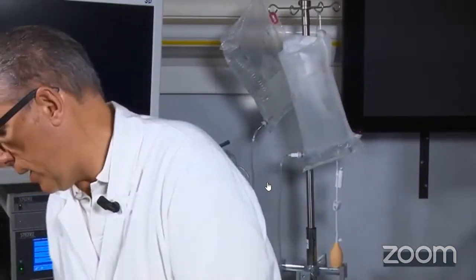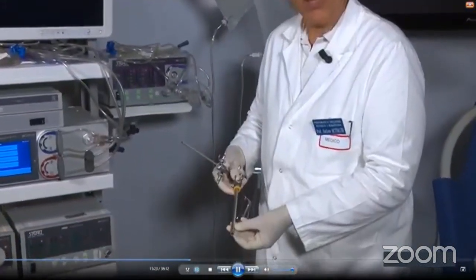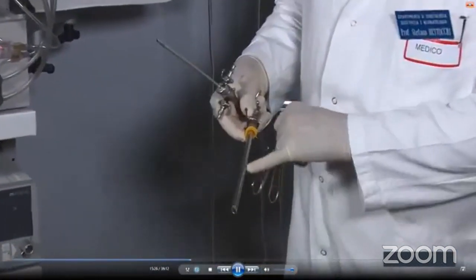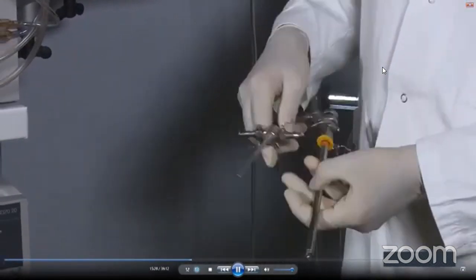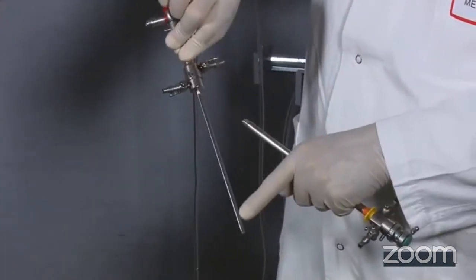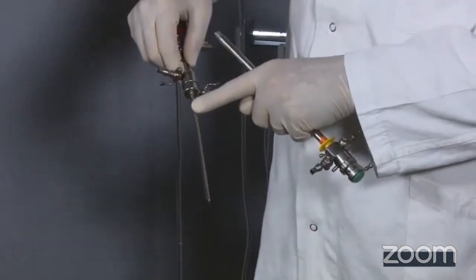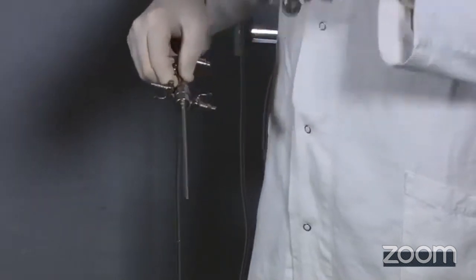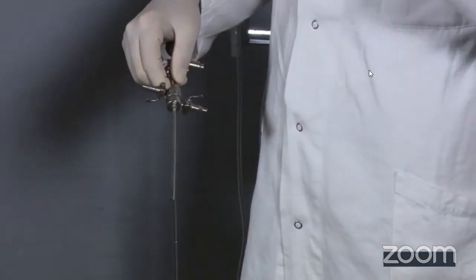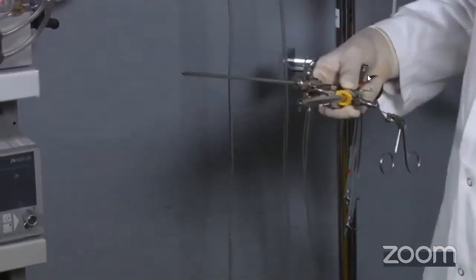And this is the same concept when we move to our instrumentation. Here we have a lot of holes, you can see, a lot of holes all around the sheath of the scope, and a very large channel inside. While in the office hysteroscope, we have only 5 holes on one side and 5 holes on the other side. And the channel inside is a very, very narrow channel, 20 times smaller than the resectoscope.